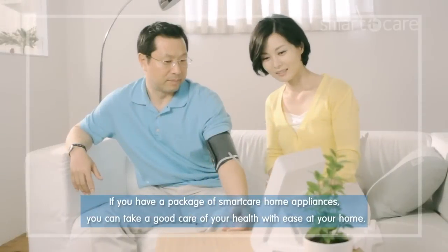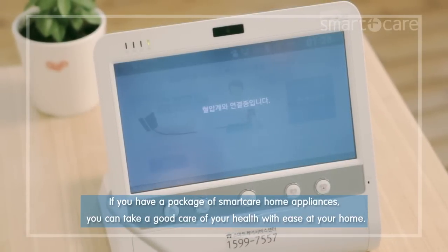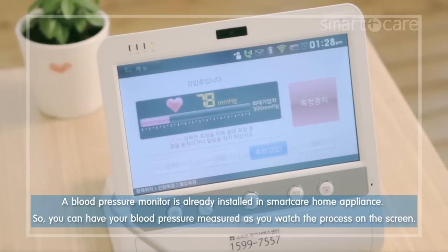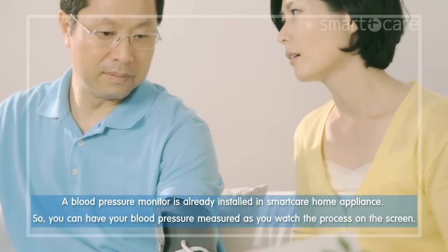If you have a package of smart care home appliances, you can take good care of your health with ease at your home. A blood pressure monitor is already installed in the smart care home appliance, so you can have your blood pressure measured as you watch the process on the screen.